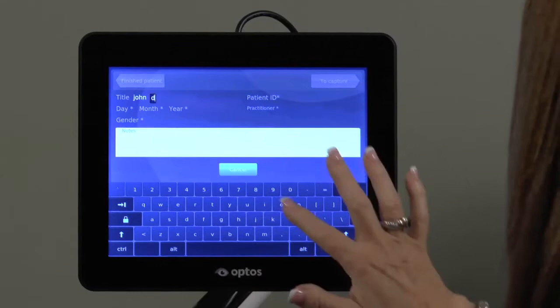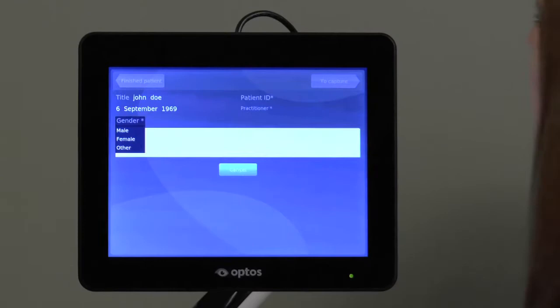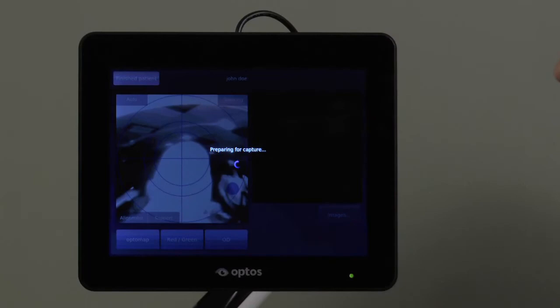Then enter the date of birth, which is in day, month, year format. You must also select the appropriate gender. Enter the patient ID and choose the practitioner before tapping the capture button, which will initiate system run-up, which takes approximately 15 seconds.